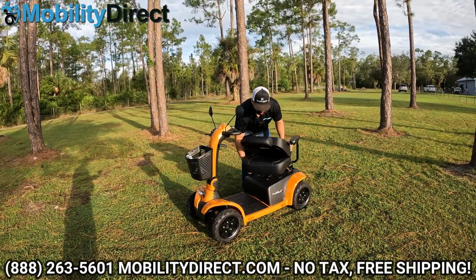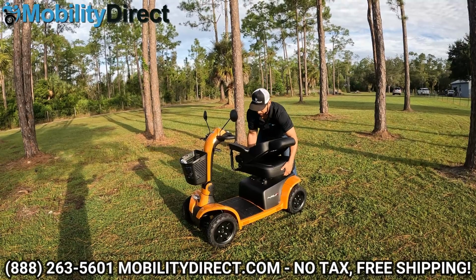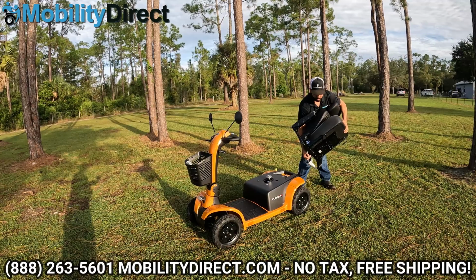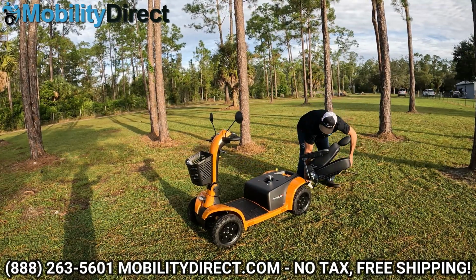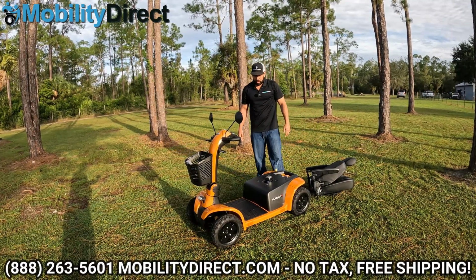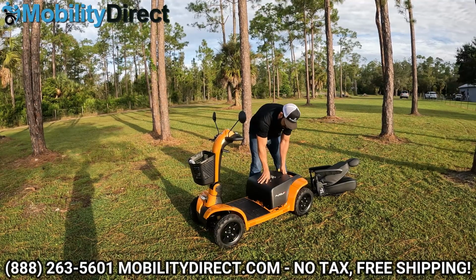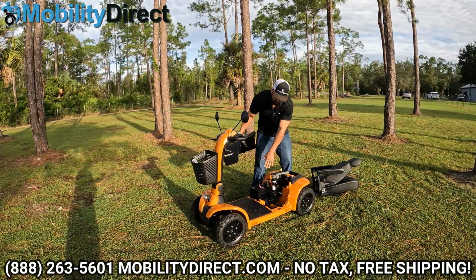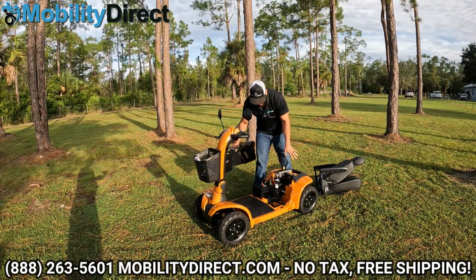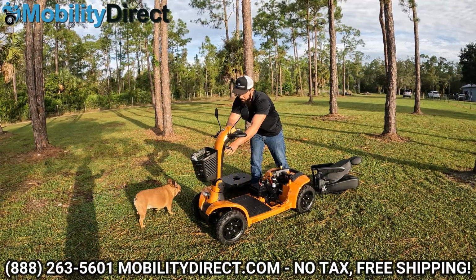So with the seat folded down, basically what you could do is pick straight up. You do have to wiggle it a little bit. There's a male connector at the bottom of the seat in the middle that fits into that seat post. So it does just drop in and you can pick straight up and take it out. So what I would do is pick up the shroud cover, remove either the single battery pack or the dual battery pack to save weight, and then you can think about lowering the handlebar assembly.